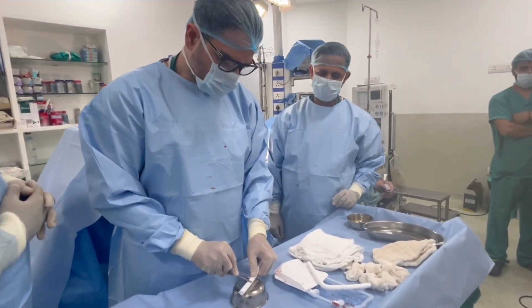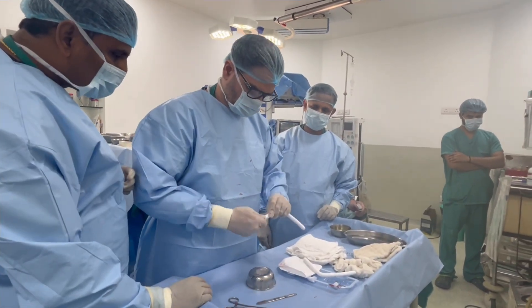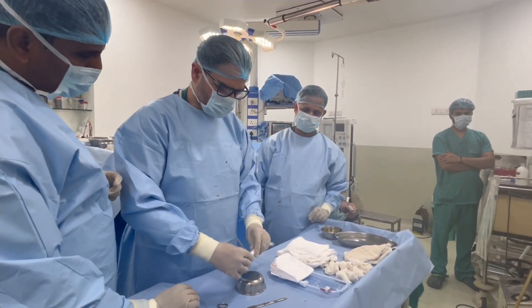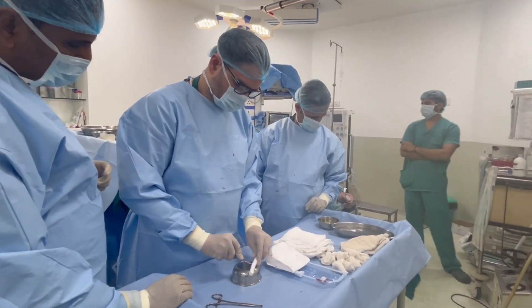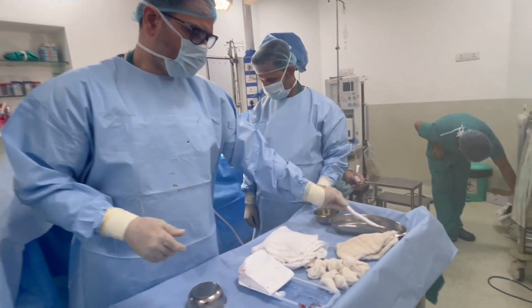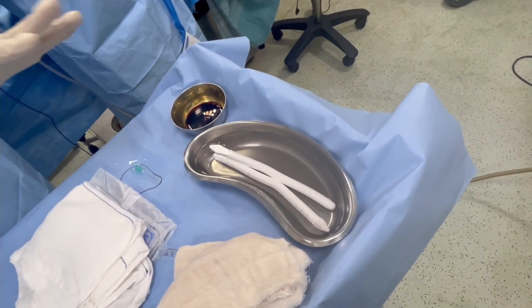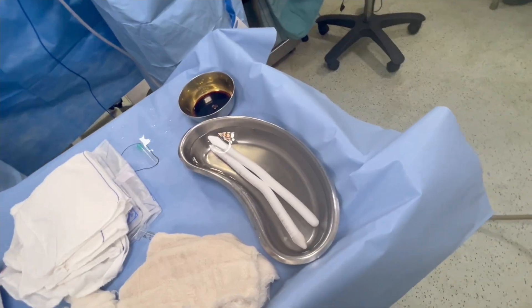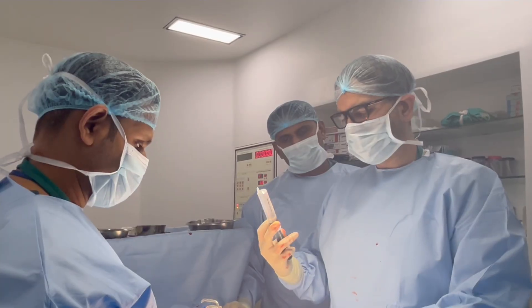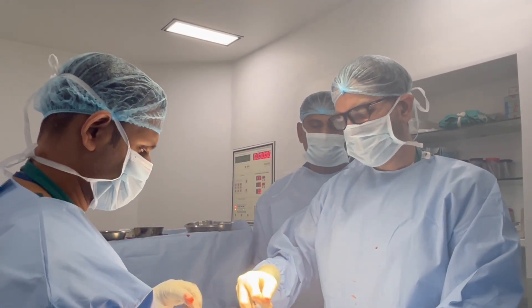We will cut it to 22 cm because we have measured it. We put it in the antibiotic solution. We will cut the other implant too to 22 cm and put it in with a rear tip extender in the antibiotic solution. This antibiotic solution contains gentamicin, vancomycin, and fluconazole — three antibiotics. Before putting the implant in, we irrigate the entire wound and give antibiotic wash to both corpora.